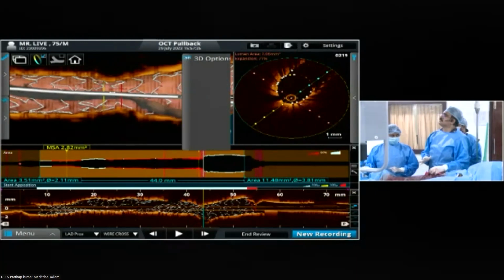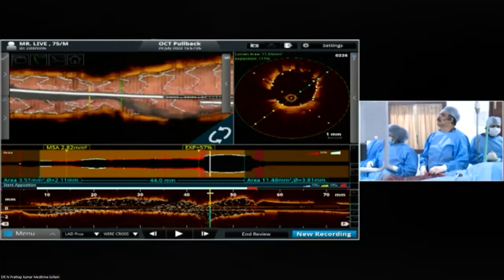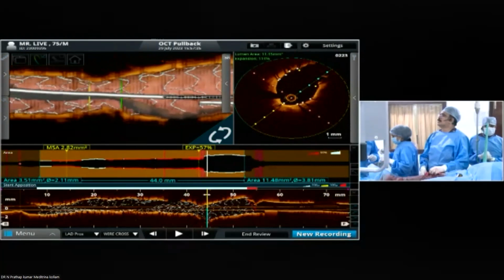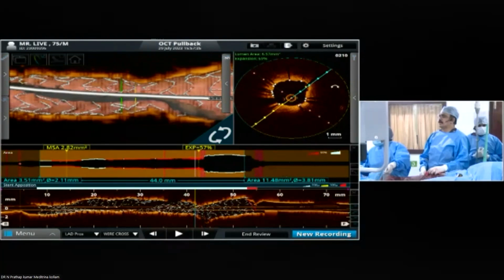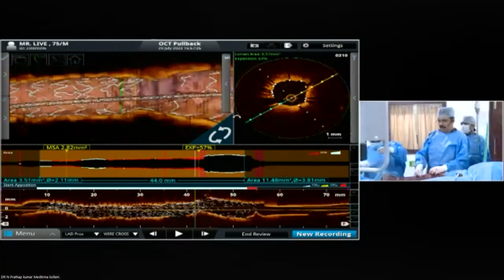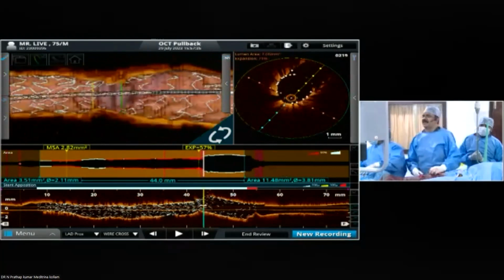Lot of struts. Well, not clear. Yeah, maybe it's possible to do this under OCT view. Sir, may I have a question, please? Yeah, please ask the question to the 2 people sitting there. They will give you the answer.